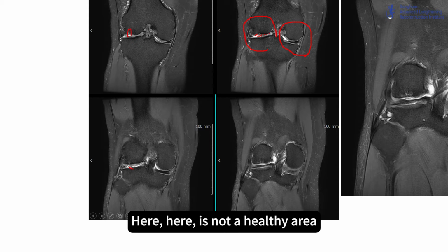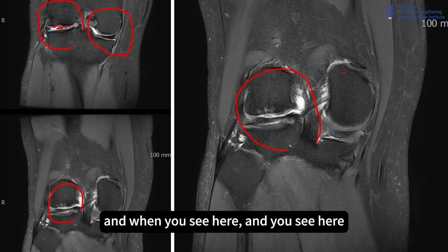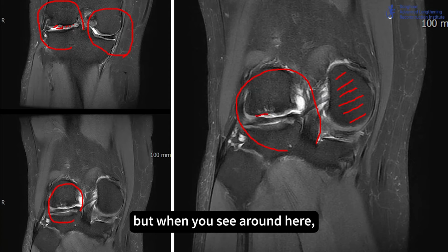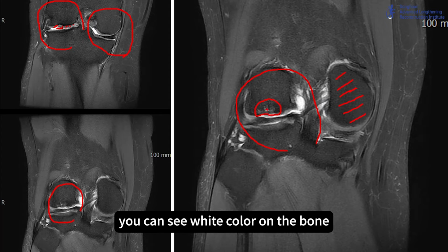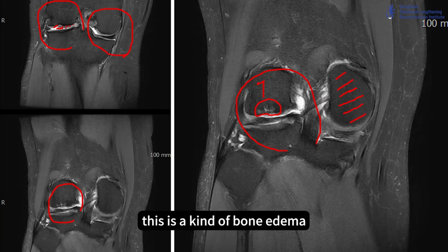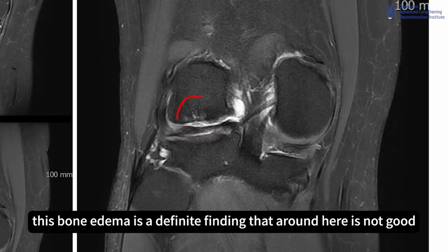Here is an unhealthy area. And here, this is healthy bone. But around here, you can see a white color in the bone. That means there is a water element in the bone. This is a kind of edema, bone edema. Bone edema means this area is under big stress. This bone edema is definitely a bad finding.